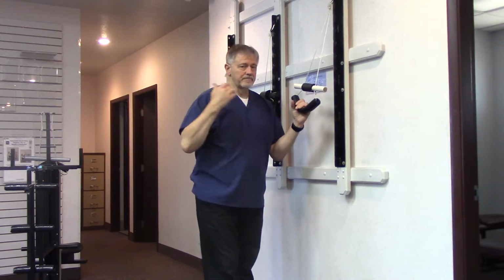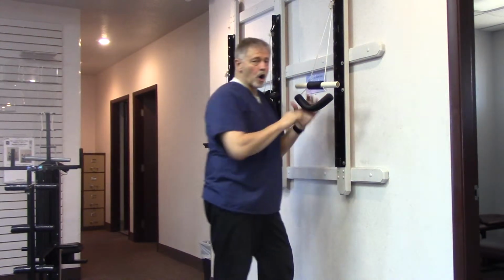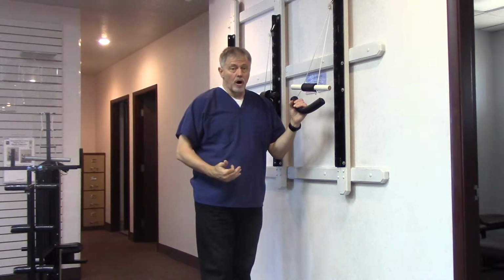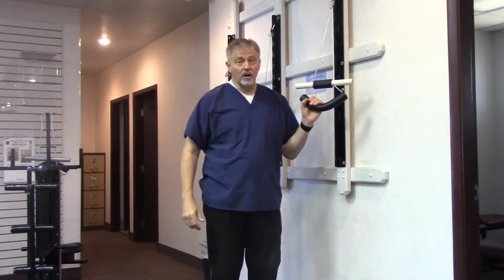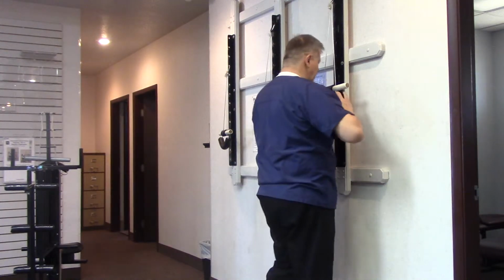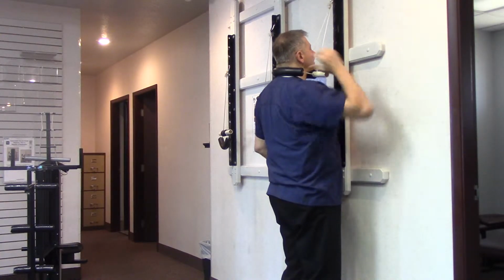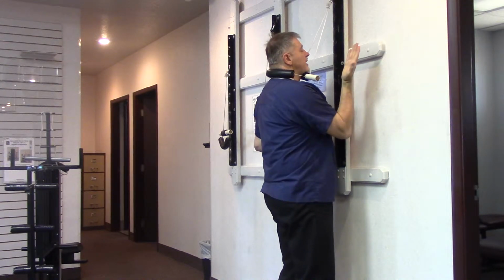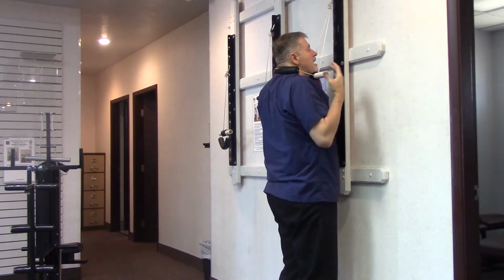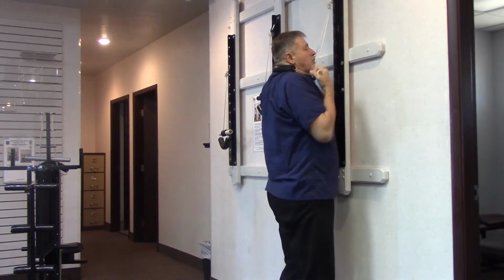But just the basic idea of doing the traction, we're going to get our feet close to the wall. When I'm at home, I have it hanging on my door. I put my toes against the wall, and when I bend my knees, my knees are going to be against the door too when I go down. So with this, it's a little out of the way, but I'm still going to get close. I put this behind my neck, and then I'm going to allow it to cinch up against my skull. I'm going to put my palms towards me and take hold of the handle here on both sides. And I like to bring my shoulders back this direction, and I like to pull straight down.